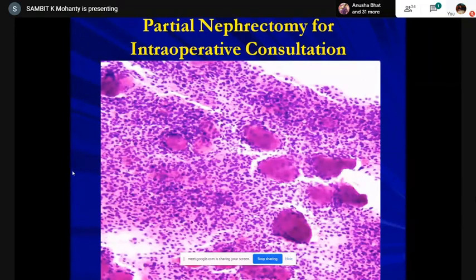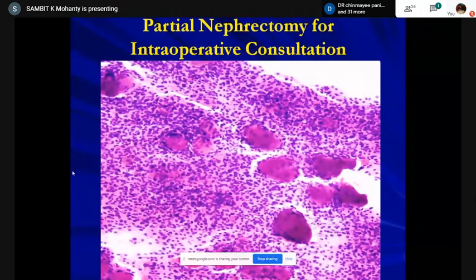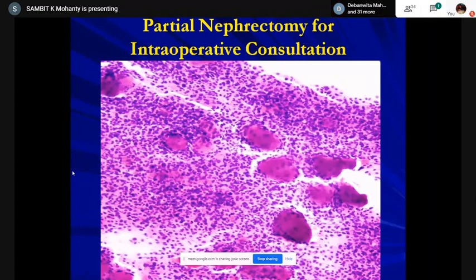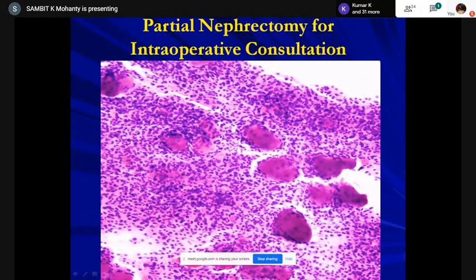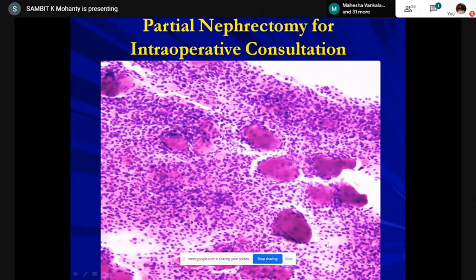With regard to my PGI training, I always do intraoperative scrape cytology on all my frozen sections to save time — done in about two minutes instead of waiting 20 minutes for a section. The intraoperative cytology showed thin structures with cells draping around them and some cells in the center. It was a pretty cellular smear. Cells were not clear; they were mostly round with some spindle cells and some cytoplasm.